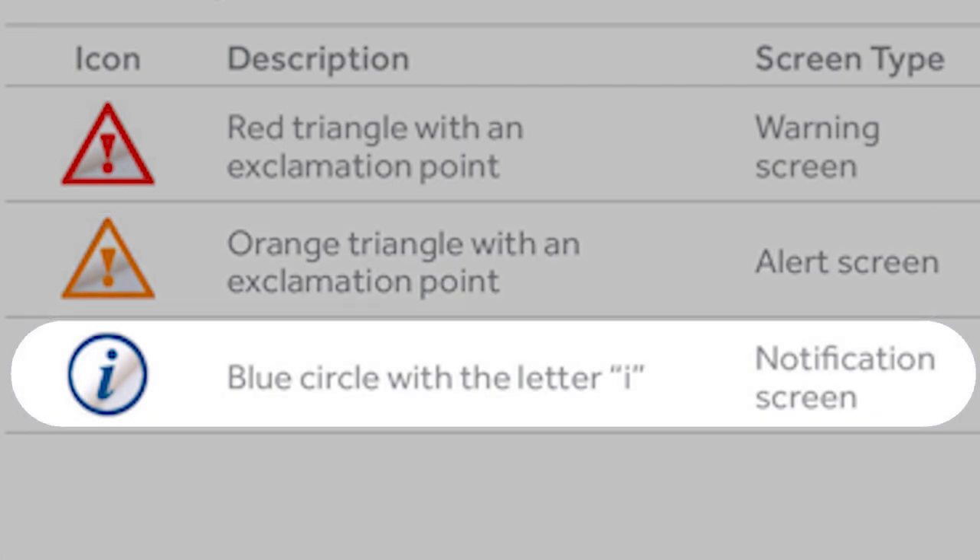A blue circle with the letter I is a notification screen. Notification screens provide more information about stimulation settings, error conditions, and battery levels. See pages 181 through 186 of the controller manual for more explanation of each notification screen.